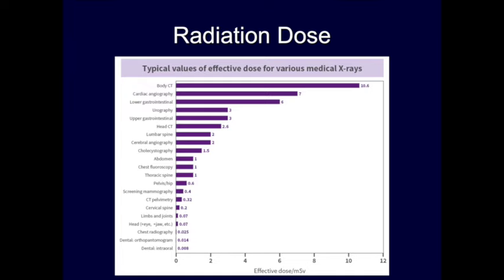As you know, chest x-rays use x-rays, a form of ionizing radiation. And it's probably important that you know about how much radiation that is and how to explain the radiation dose to patients. This bar graph shows typical effective radiation doses for different imaging studies in millisieverts. It's important to know that the background radiation dose that we are exposed to by just living on Earth, which is very low, is about 3 millisieverts per year. This helps us put these doses into perspective.